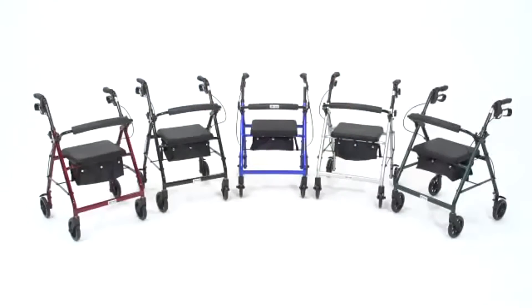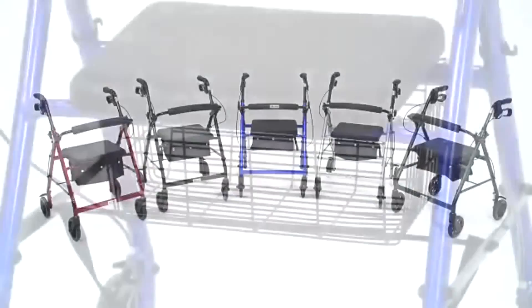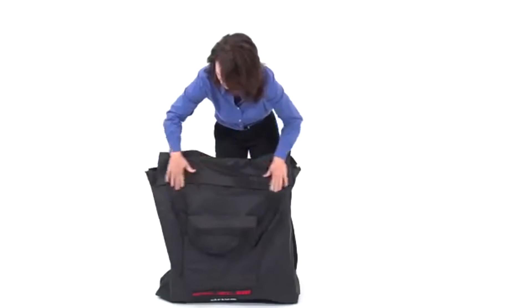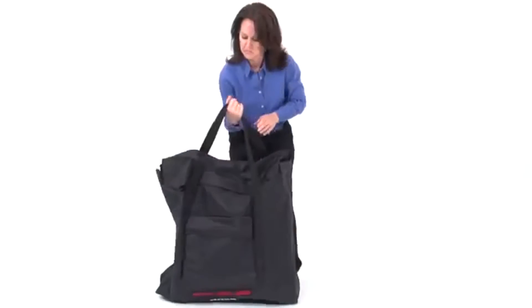This folding rollator comes in five attractive color options. Users also have the option of adding a basket, cup holder, and patented light and go mobility light. And for added convenience, the rollator can be stored and carried in this compact carry bag.